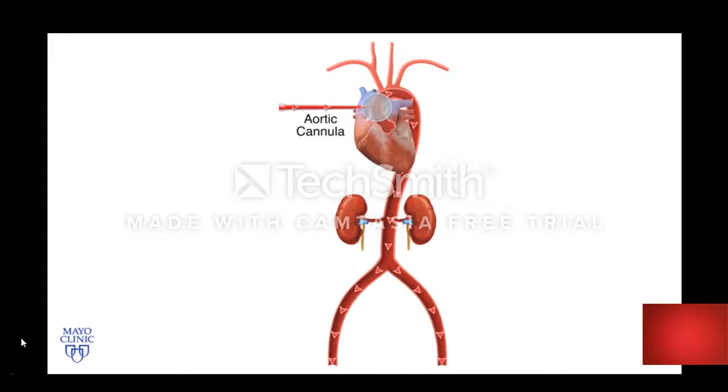However, as the heart recovers and begins to beat, the aortic valve opens and allows blood to flow from the native circulation. The native circulation now mixes with blood exiting the centrally placed arterial cannula. The composition of the blood distal to that mixing cloud will depend on the relative outputs of each of the two circulatory systems.